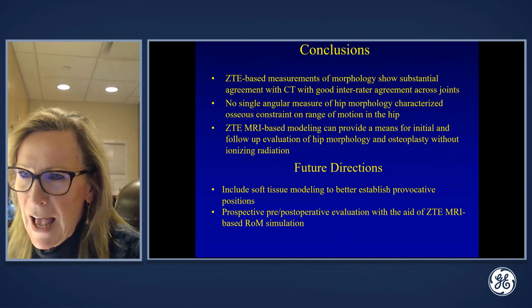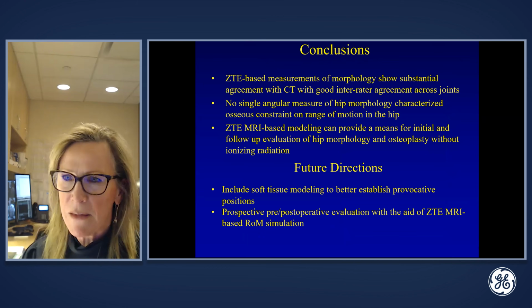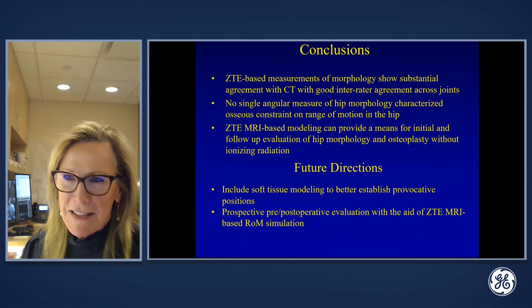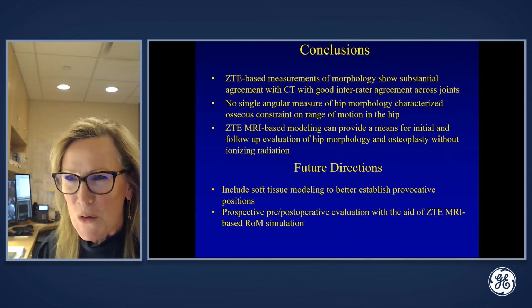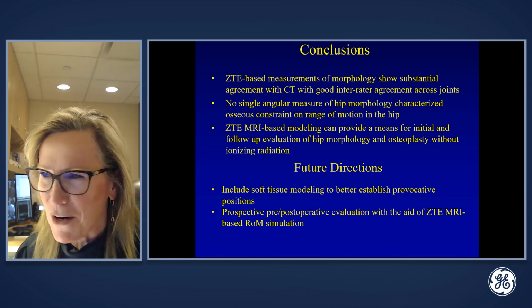So number one, how do you get your orthopedic surgeons on board? Just make them aware that it even exists. I like to sneak it in and try to fool them, and then they'll call you and ask you, did you order a CT on my patient? You say, no, it's all MR data.